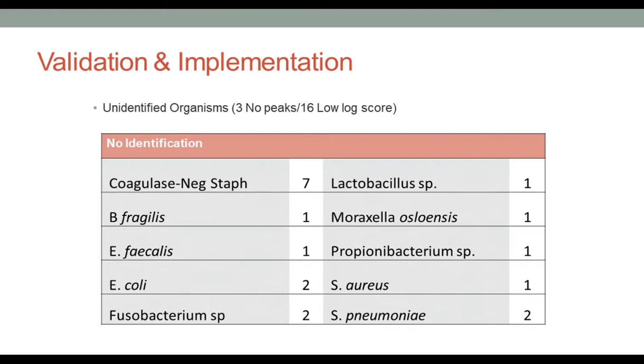Is this currently FDA cleared on the Bruker MALDI? It is not an FDA cleared process or kit. It's a research use only kit, and we have validated it in our laboratory for this testing. When we did our validation study, we looked at the organisms that are the most common things that we see in our blood cultures, and we did a validation to allow us to identify them based upon our information here. My understanding is there is an FDA approved kit that's in the works, but it's not available yet.